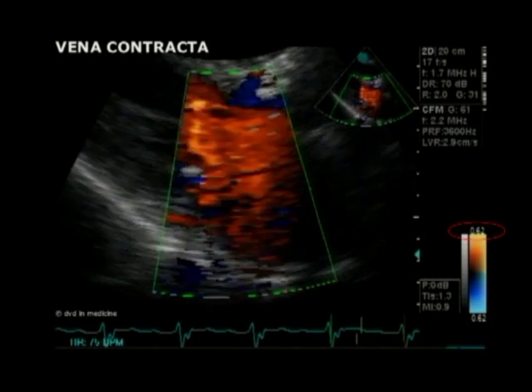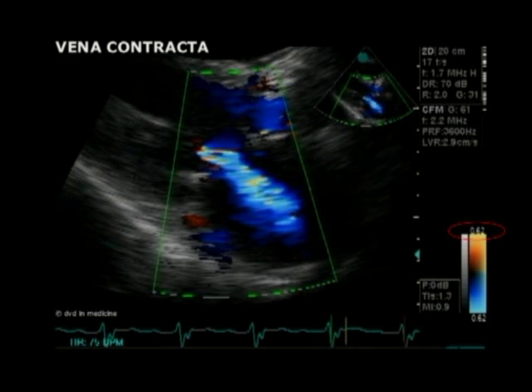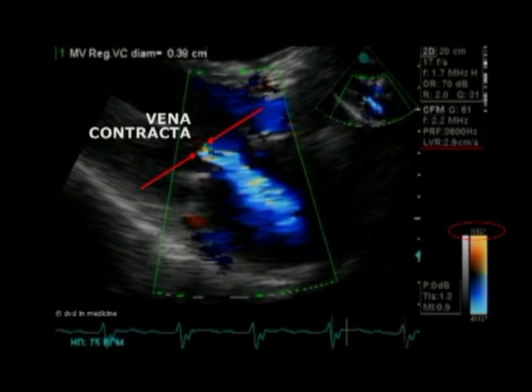The vena contracta appears as the well-defined light blue or light yellow high-velocity core on the red-blue color Doppler scale. This portion of the regurgitant jet, unlike the flow convergence zone and the distal turbulent jet profile, most closely mirrors that of the actual regurgitant orifice. Therefore, it is a more reliable marker of MR severity with significant advantages over other methods provided that the recommended technique is used.